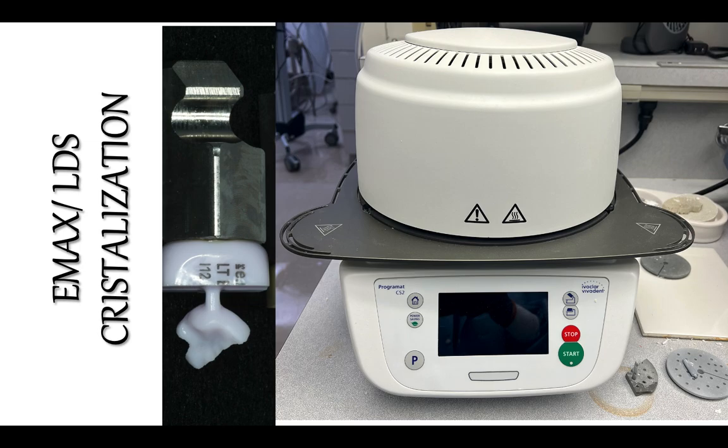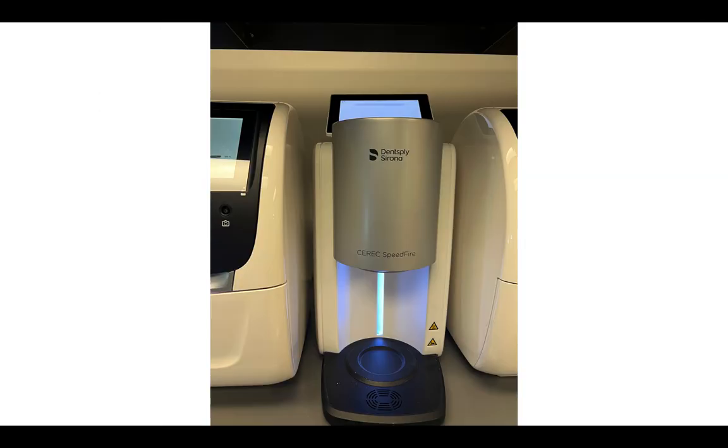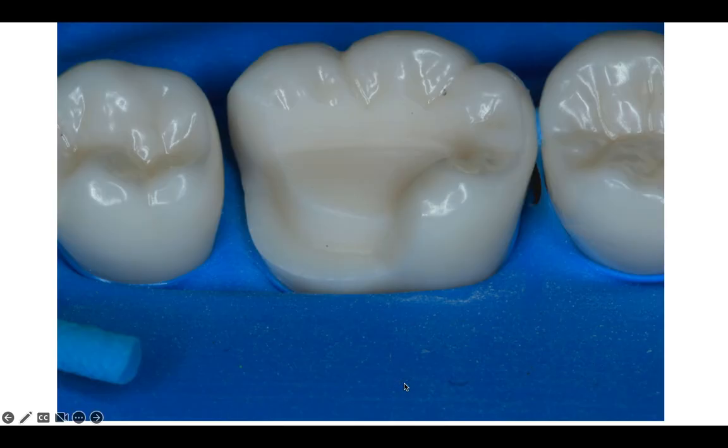And then you try it on the patient, and then you bring it back to the ultrasonic bath to clean it from alcohol, from blood or from saliva before cementation. This is also another speed fire. This is super faster and it's wonderful. And this is also the one that we are not using. It's Grad Operative, the one that uses it. And this is most likely to sinter zirconia.